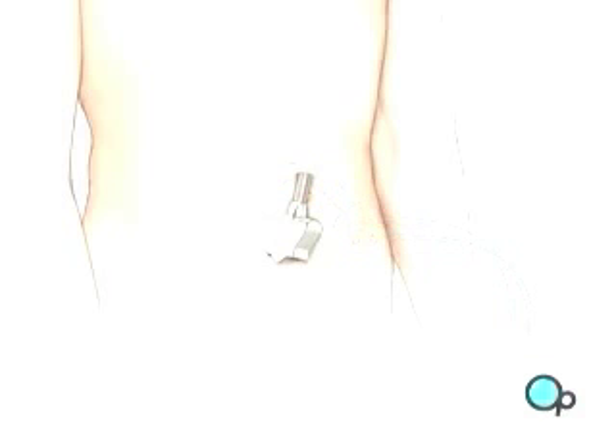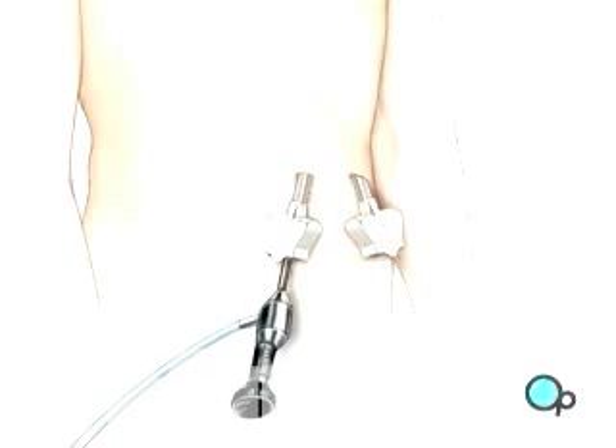An umbilical port is created for the laparoscope. One or more incisions will be made, with care taken to keep the openings as small as possible.